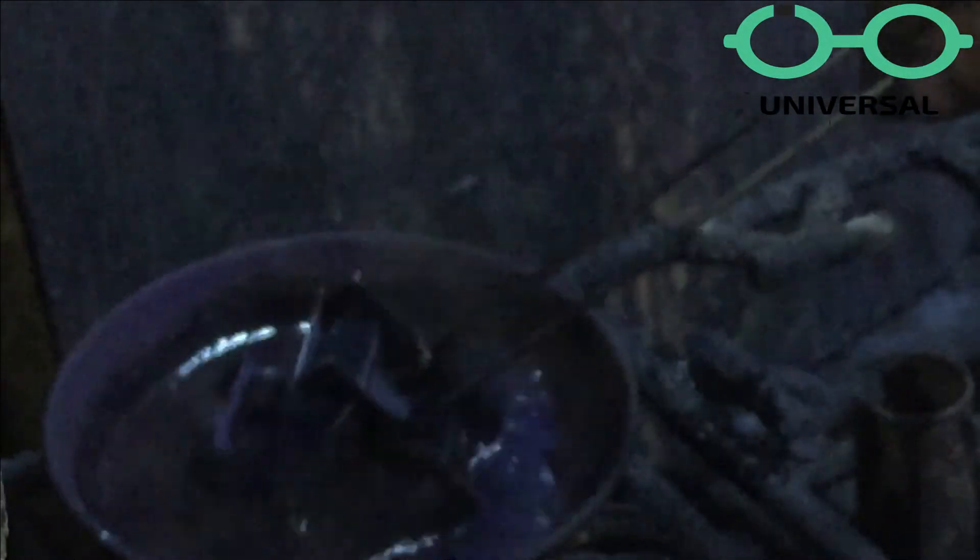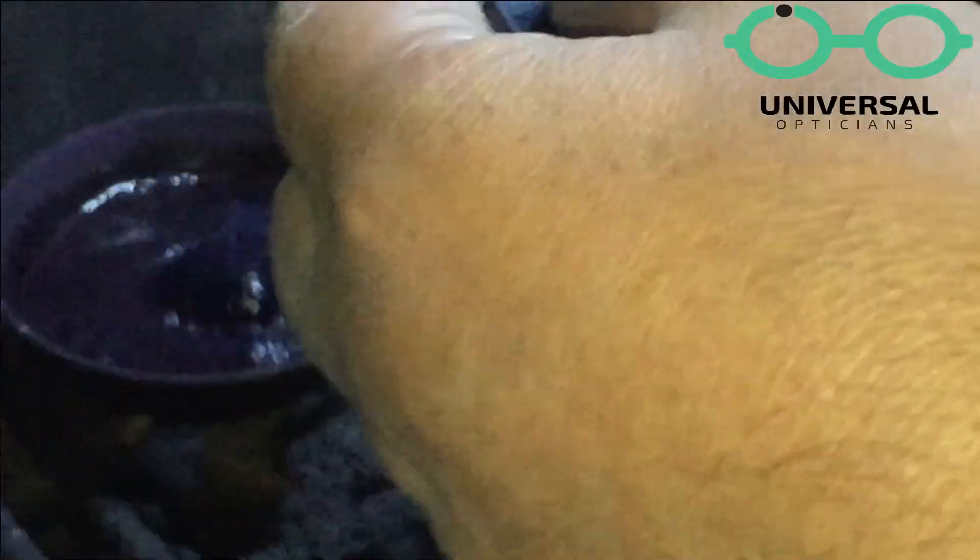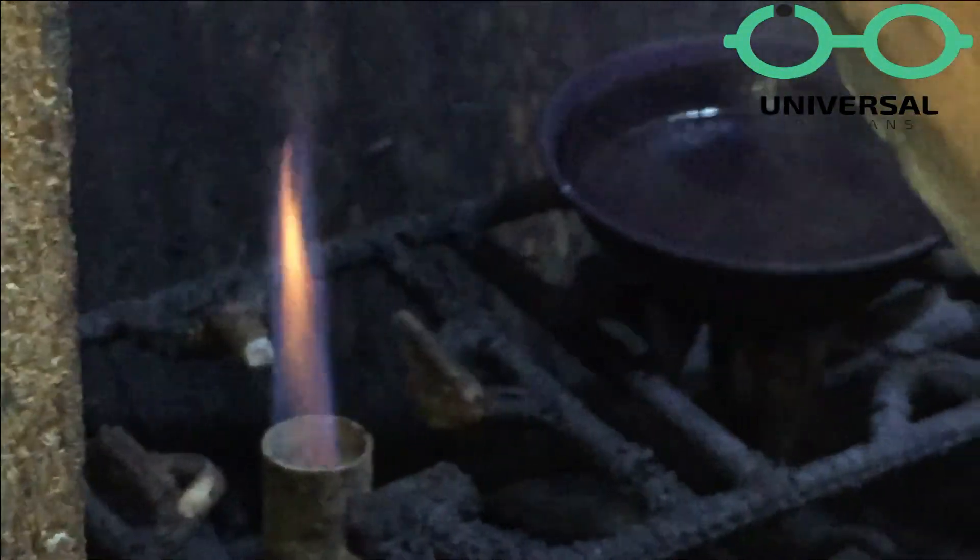Now we start the color section. Color is a very difficult job. Whatever color we use, we mix the powder in hot water. After mixing it in hot water, we have to measure it. It is a very sensitive part and a very difficult job.